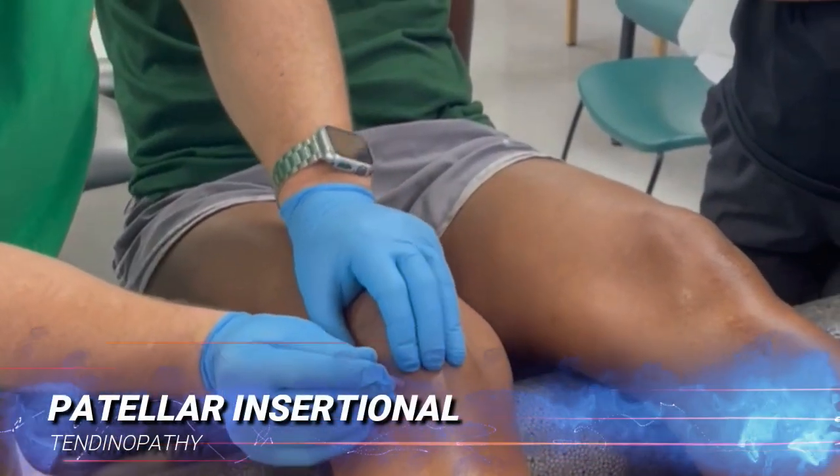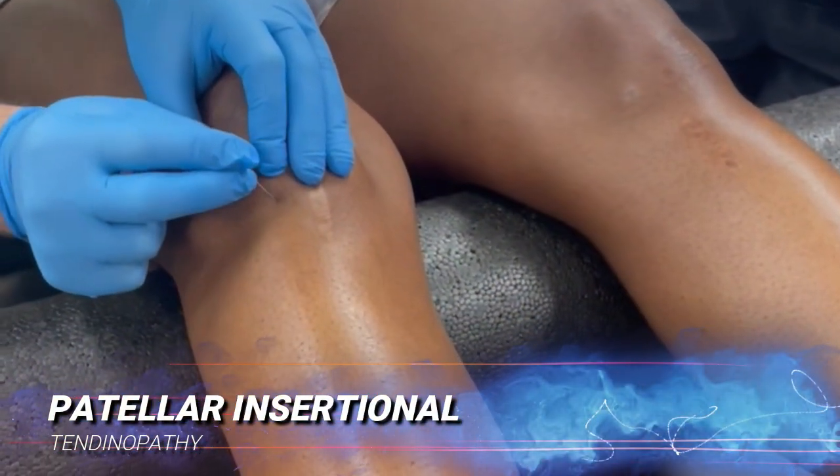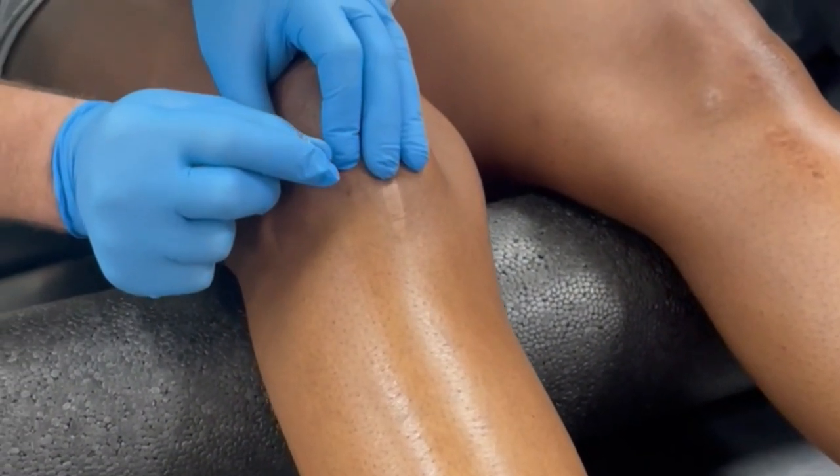I'm going to needle towards her tibial tuberosity — tap this in, send it down towards her tibial tuberosity. It's real gummy. And there's her tuberosity, but it is real gummy.